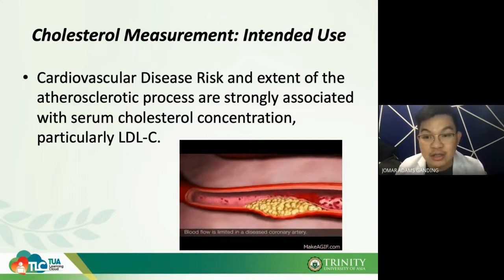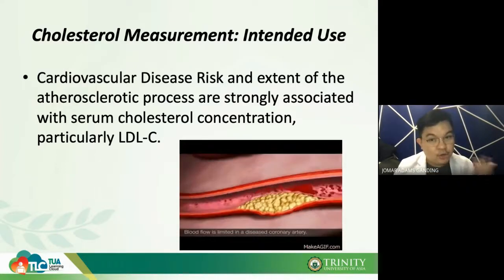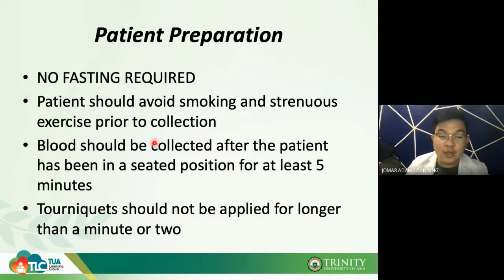Whatever you eat, it will not actually affect the cholesterol levels of your body because the cholesterol that is in your bloodstream is produced from your liver. Okay, so having said that, let's go to your patient preparation. I just want to reiterate that there is no fasting required for your cholesterol.